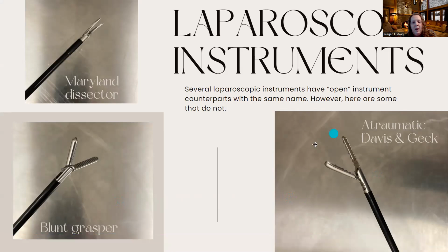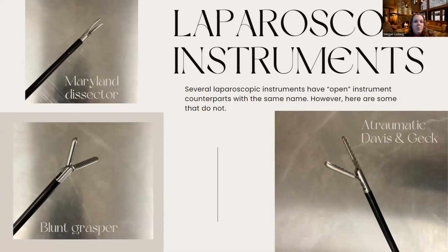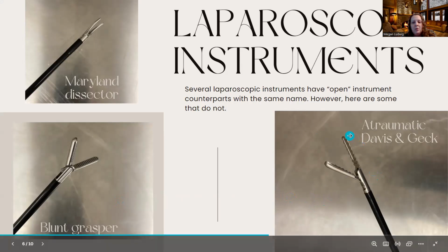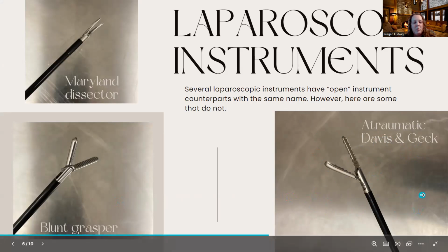But, and we have a surgeon around here. So I'm from West Virginia. Really, we're right on the border of West Virginia and Ohio. So we have a surgeon that will call this the West Virginia grasper because it doesn't have teeth. And then we have one that does have teeth on the end, and it's called an Ohio grasper because it has teeth. So just a fun little, we can joke about it because we're from here.